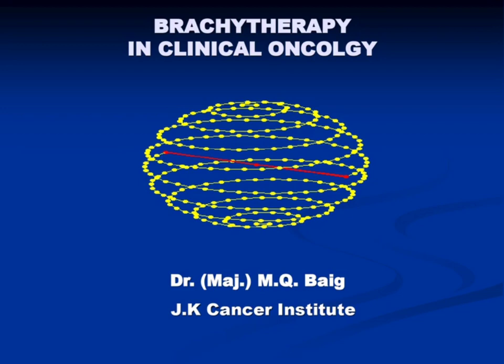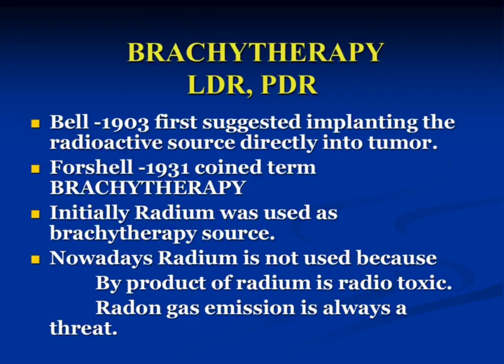The clinical outcome of the patients, the small tumor, organ preservation is all included in clinical, interventional brachytherapy. So I'll be dealing with all the basics of brachytherapy, clinical oncology, a few clinical tips on where, what we use, how we use, and what are the components of brachytherapy.